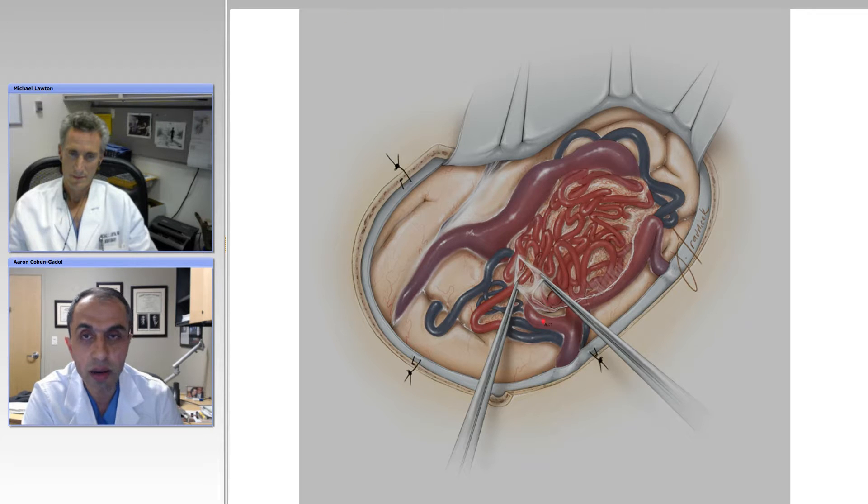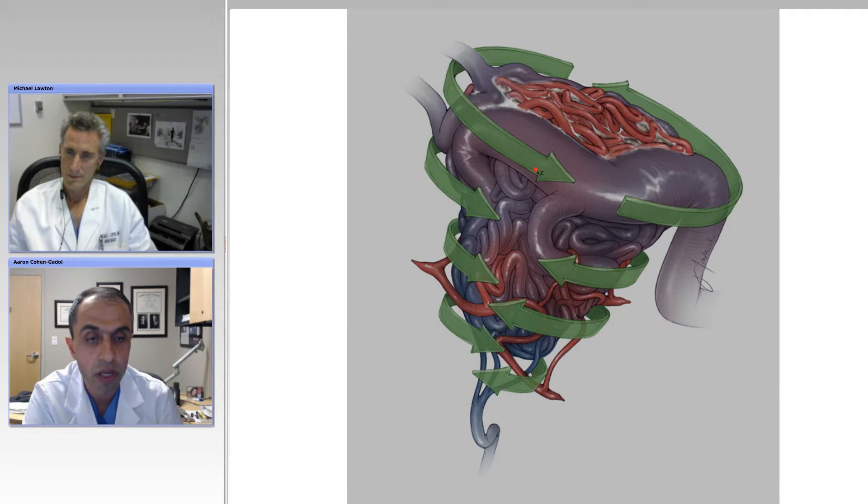The next step after wide exposure is arachnoidal dissection. Getting the feeders very superficially and going around the arteriovenous malformation in a circumferential fashion. As Dr. Spetzler has previously mentioned, leaving the veins intact as much as possible and creating small channels along the nidus — disconnecting the feeders deep, which can be the most difficult part of the operation. As long as you leave the veins intact, you leave the flow within the nidus untouched, and that prevents intraoperative hemostasis challenges.